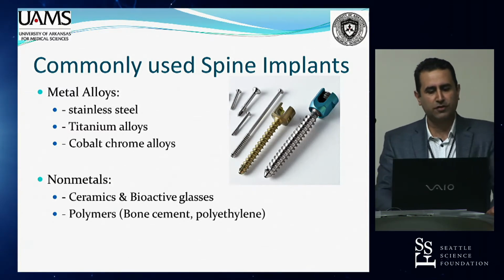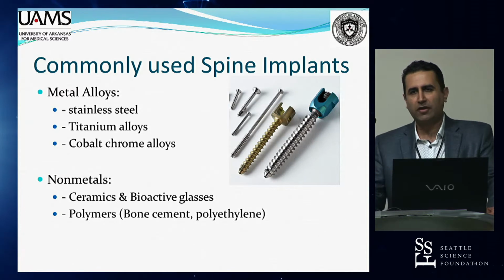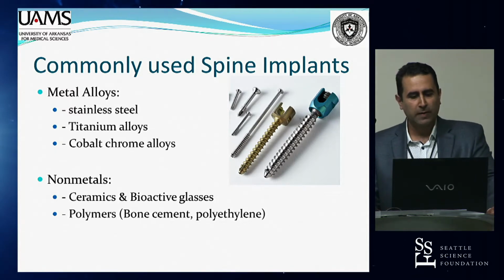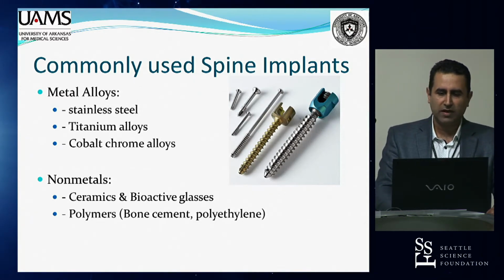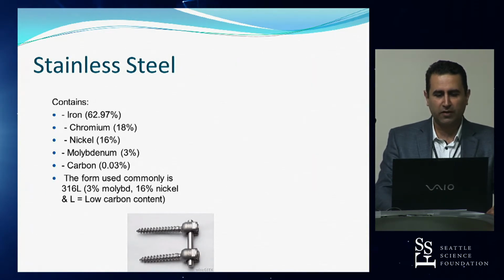But there's also non-metals too, such as ceramics and these bioactive glasses. And I think that they're kind of proprietary inventions that come out from time to time with the benefit of better osseointegration into bone. And also other things such as cement that we place often through our pedicle screws or through needles into the bone itself. So let's talk about stainless steel very briefly.